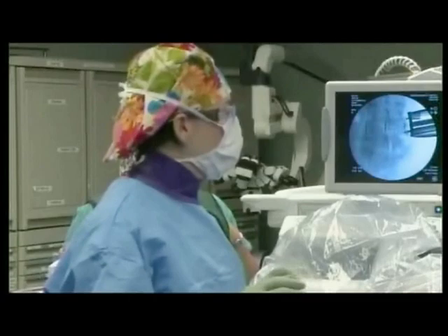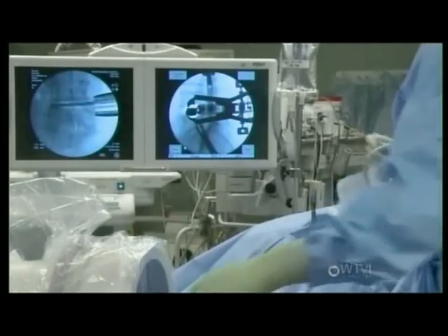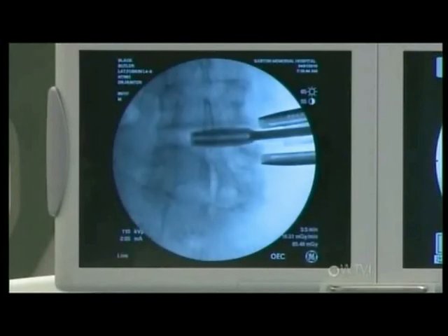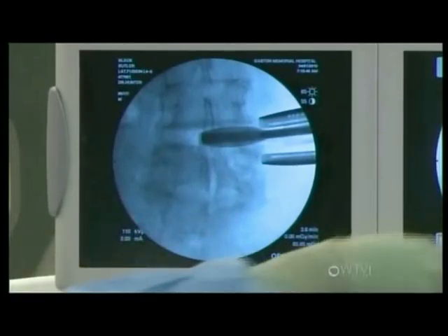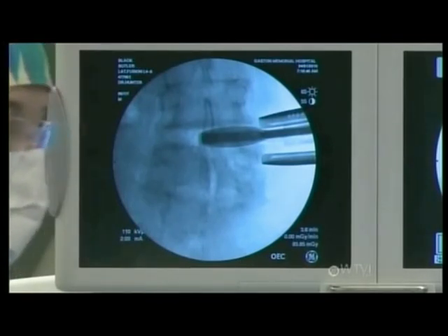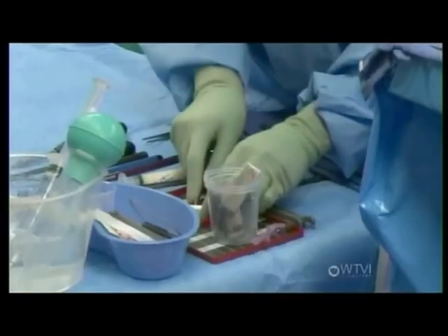So now the disc has been removed. We're now in an area where we just need to figure out what kind of graft we're going to put in. It's a big space — one of the biggest spaces I've really operated on. This gentleman has had pain for the past five to six years of back pain. He's been through all conservative treatment: medications, therapy, injections. Since he's not any better, he felt he could no longer continue because of the excruciating pain that he's in. And it's the only disc in his back that's causing his pain, especially in the spine.